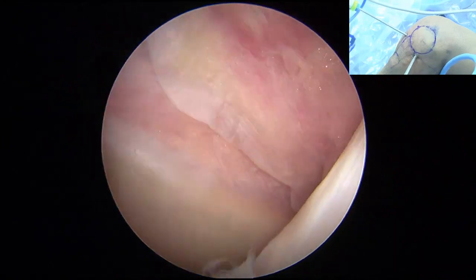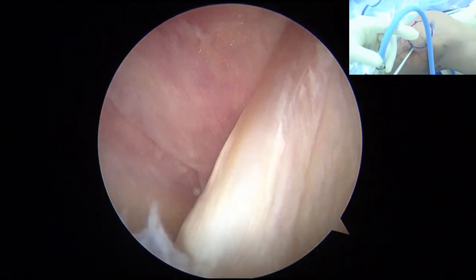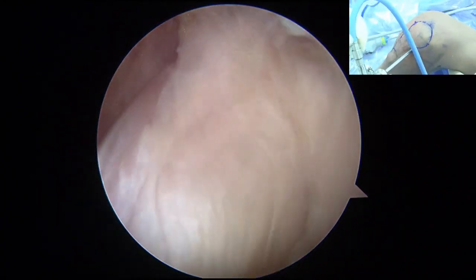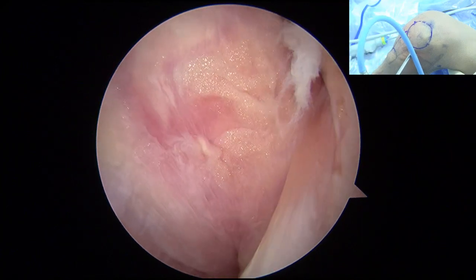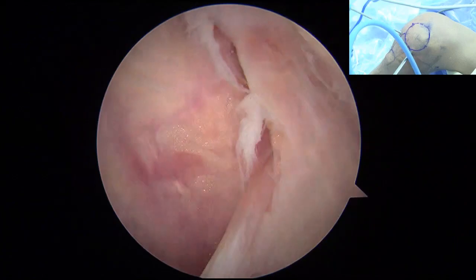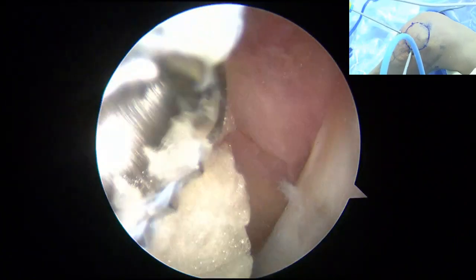那有时候病人有疼痛症状呢，往往就是因为前方这里有软组织或者是脂肪的卡压，所以要先清。Okay, good. So next step is I will show you the portal that we mentioned. You see that is ACL, this is PCL, okay? 然后看到 ACL, PCL 了。So we have published the technique we call the intercondylar approach to go to the back of the joint, okay?